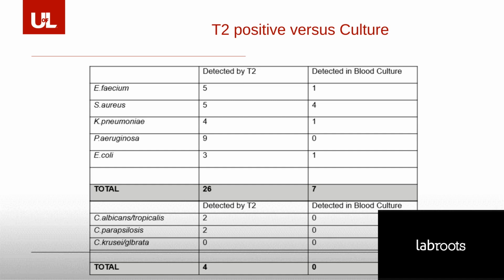And the other thing that we looked at was the negative predictive value. And the negative predictive value is very high. So what does that mean clinically? That simply means that if it's negative, you could possibly stop therapy. That's the clinician's decision, but at the same time, we feel comfortable saying you might want to consider terminating therapy. And this is where we work with our pharmacists and the PharmDs who are on the units, who can influence this on each of the respective units that they cover.